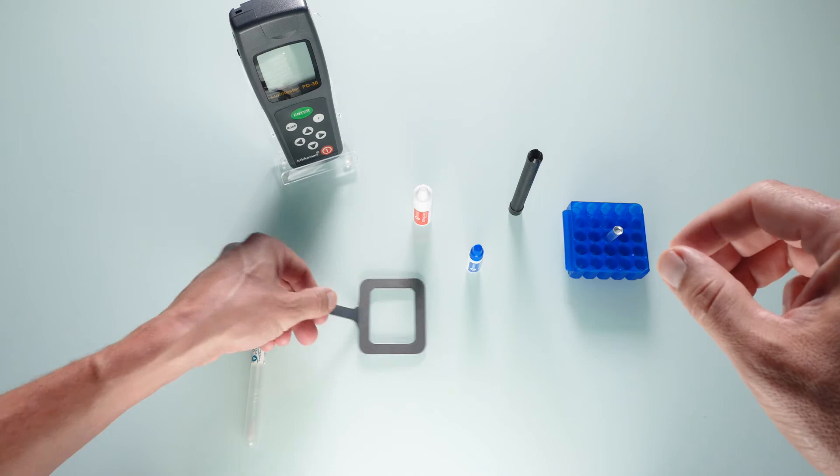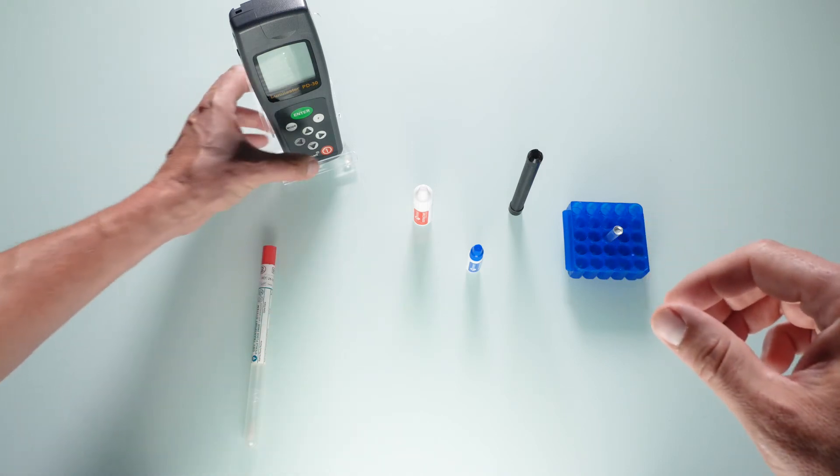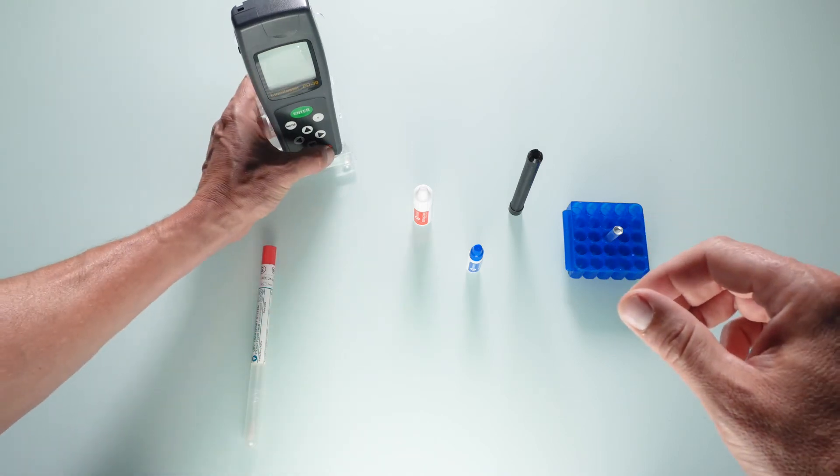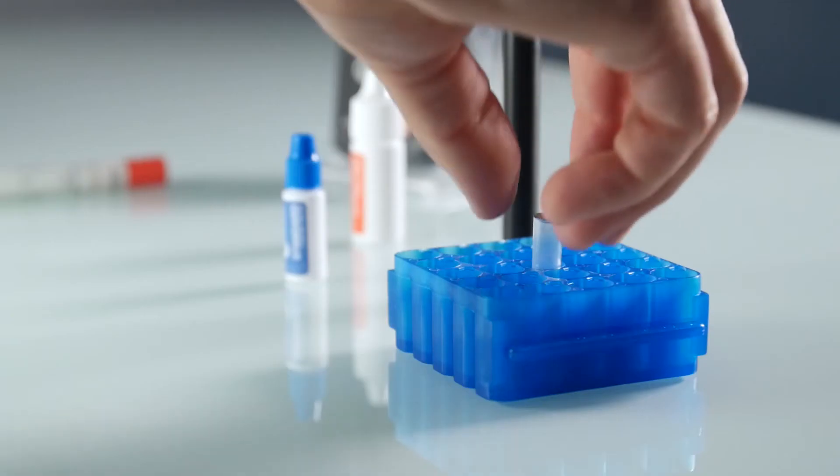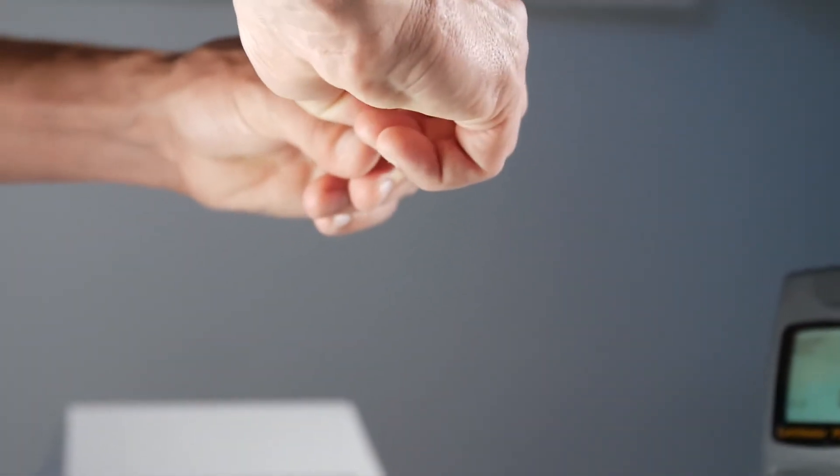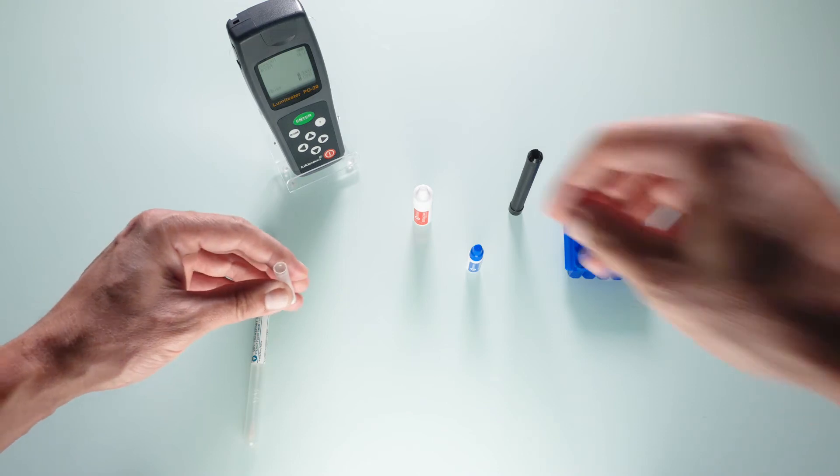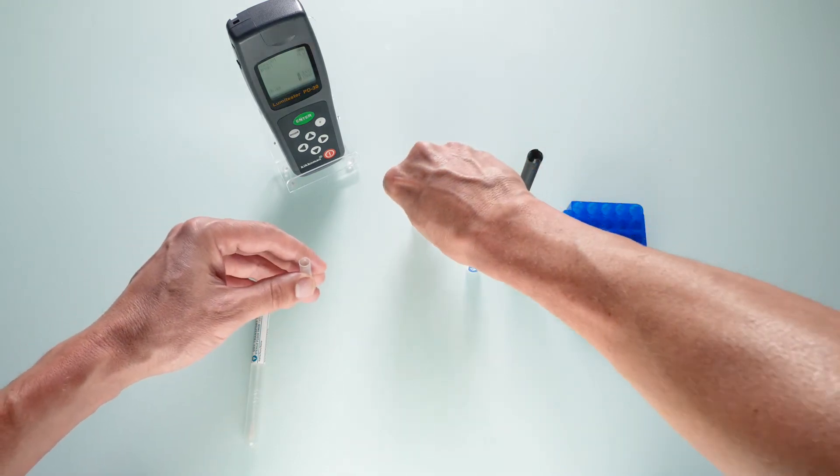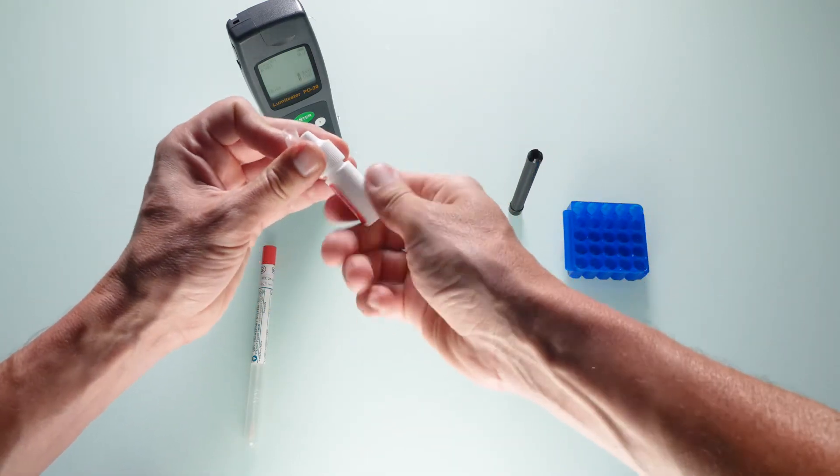Turn on the luminometer and an eight-second calibration will ensue. Peel the foil from the lid in the LumiTube and squeeze six drops of extractant inside.